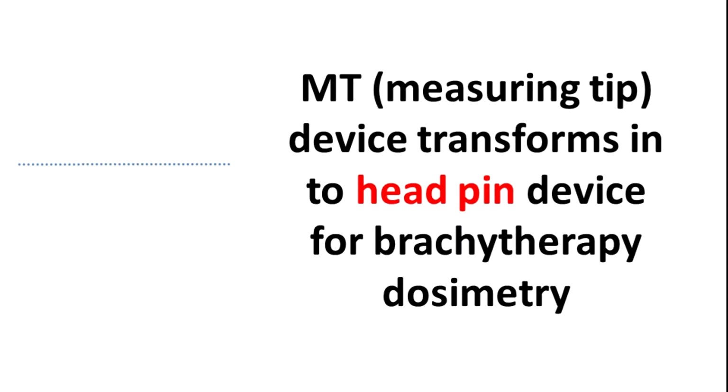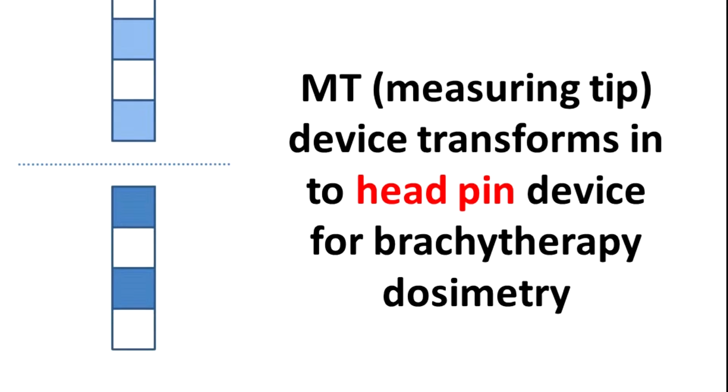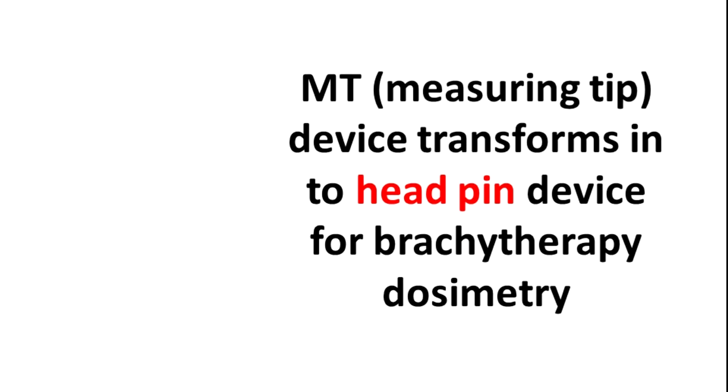In the previous presentation of the MT series, we demonstrated the excellent precision of the MT device for positioning an ionization chamber in a water phantom for absolute dosimetry in brachytherapy. The goal of today's lecture is to show you another, simpler and more practical solution for this calibration procedure, with little less accuracy than the previous scheme.